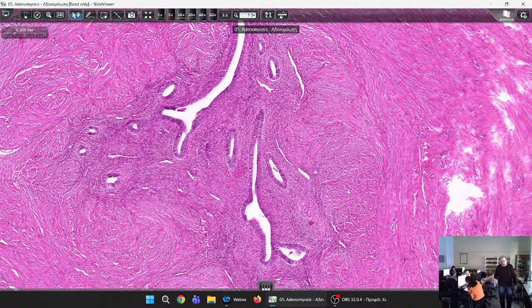And if you see these glands outside the uterus, either in the peritoneal cavity or forming cysts, chocolate cysts in the ovaries, because this ectopic endometrium follows the hormonal continuity of the cycle and bleeds like the normal, the orthotopic endometrium. So it may cause problems, fertility problems, because in areas of hemorrhage, you may have macrophages and you may have fibrosis.